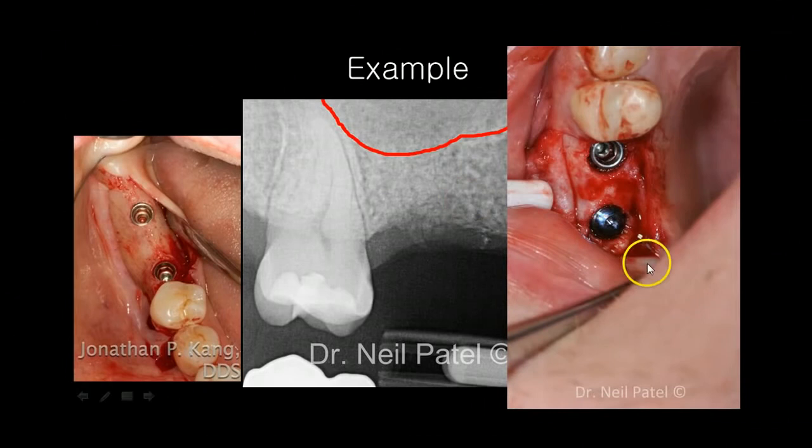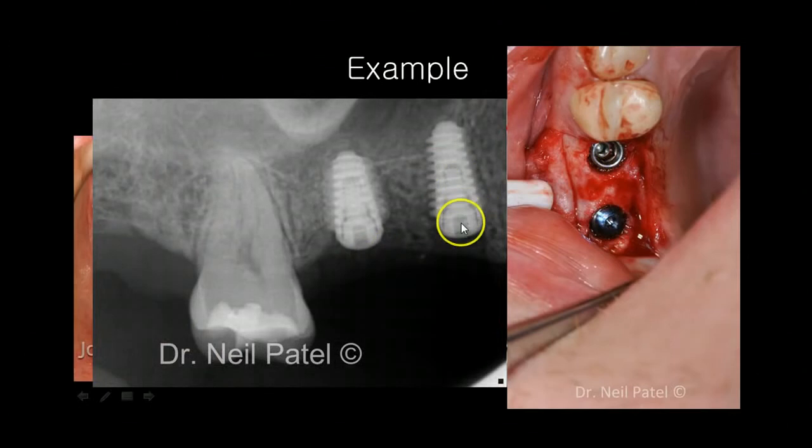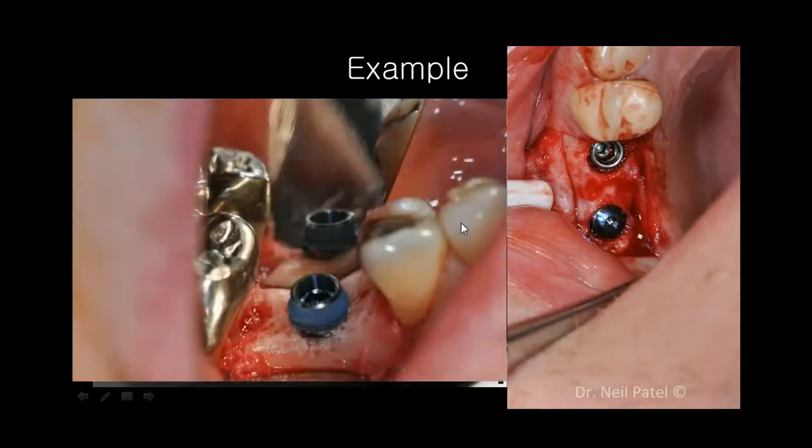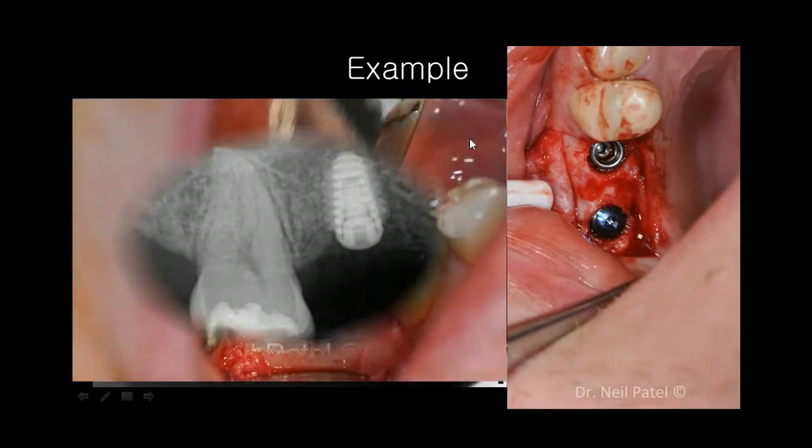Here's an actual sinus lift case. You see a small 3.3 core there and a small 3.3 core there. This implant was a 4.5 by, I believe, 8.5. Let me back up here, and this was a 5.0 by 8.5. Okay, so you can clearly see the implant stabilization. You're only removing a small amount of bone here, but you're getting maximum stabilization underneath that with your thread types.